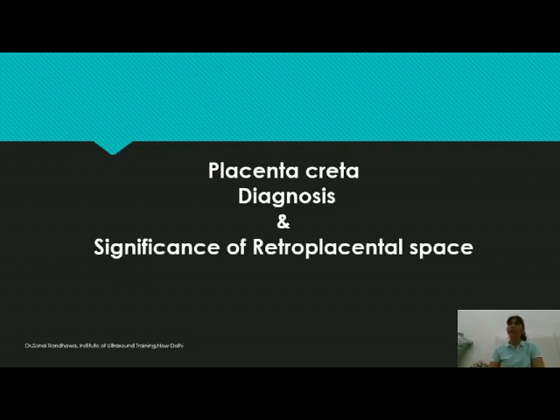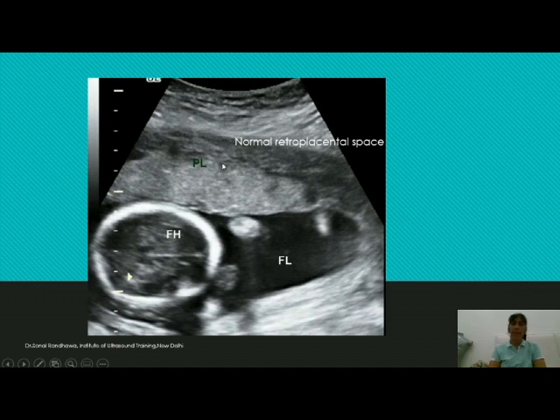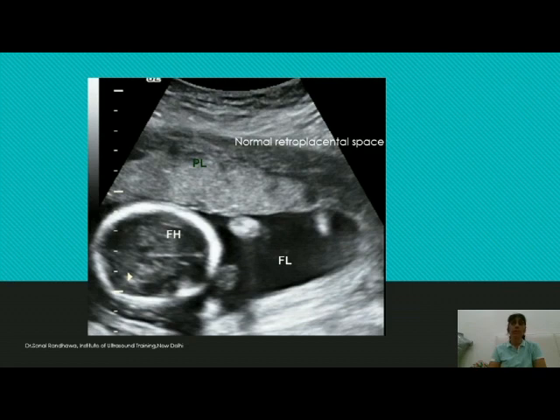What is this retroplacental space and how is it seen when we are scanning? Whenever you are tracing the placenta, always pay attention to the dark area that you see between the myometrium and the placental tissue. There's a dark area with multiple white lines. These lines run parallel to the placenta and are nothing but the walls of the retroplacental vessels. So the retroplacental space contains retroplacental vessels, and when you apply color Doppler it will show color flow.